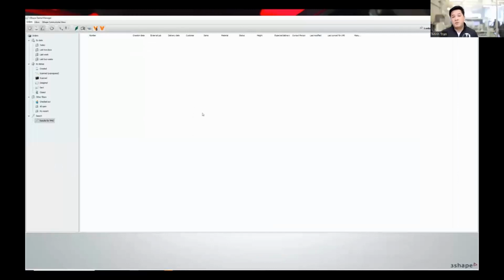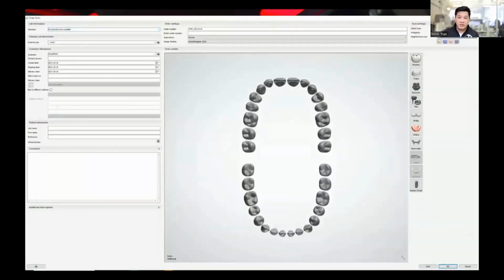So of course, in 3Shape, we make these diagnostics by selecting a digital impression. It doesn't matter if the object is a scan file or a digital impression or a model. The actual object is just a variable, so don't get too tied up on the name. What matters is the container that the program is asking for, and then you supply that container with what it's looking for. In this case, the whole reason we choose that is so we're able to select a digital model. If you don't have digital impression selected, you're not going to be able to build a model from it. So once we have it switched to digital impression, you're able to select model, and you're also able to define all your other indications.